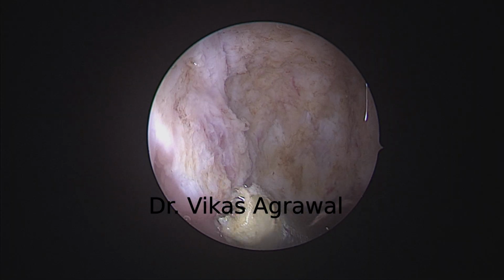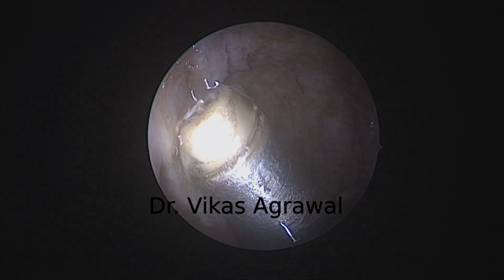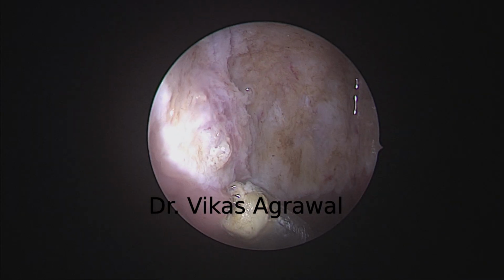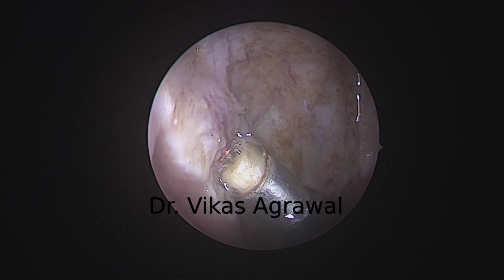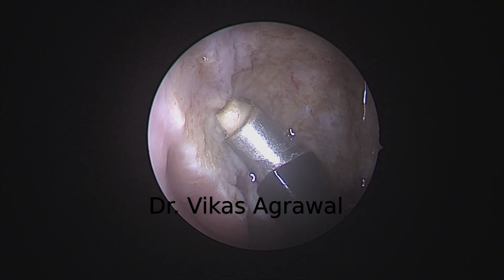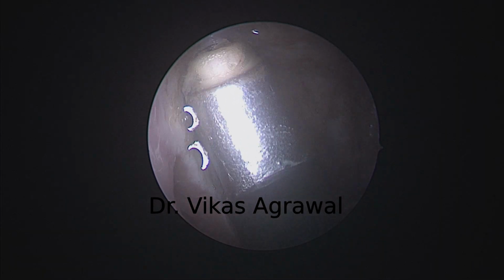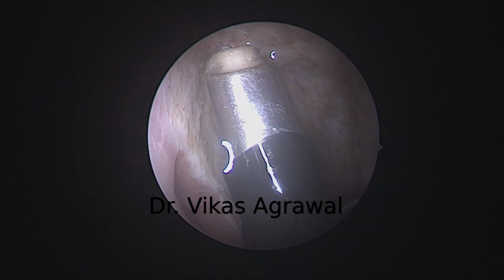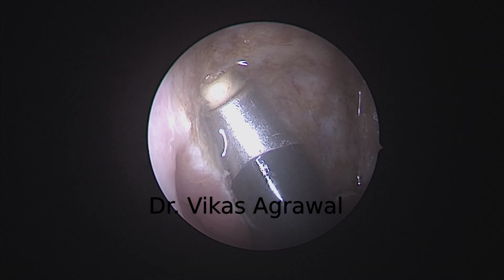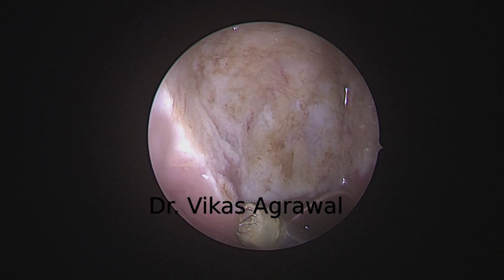Alright. So only submucosal and 5 millimeter away from the eustachian tube orifice. That's the eustachian tube orifice. I'm going to remain 5 millimeter away and I'm only removing the lymphoid tissues. I'm not damaging the muscles at all. And this trajectory as the superior boundary completely defined, and this is the lateral boundary.